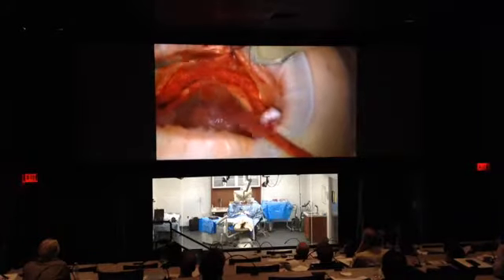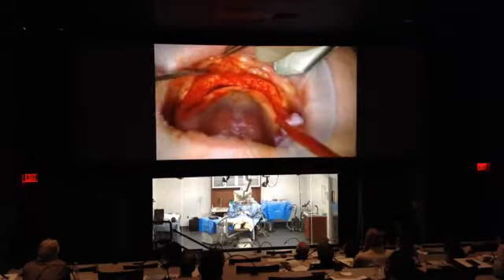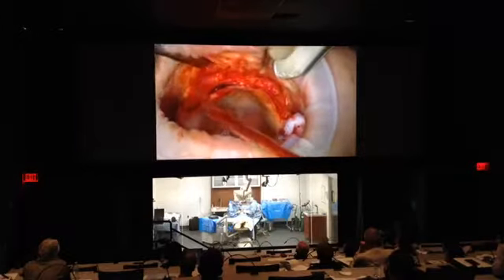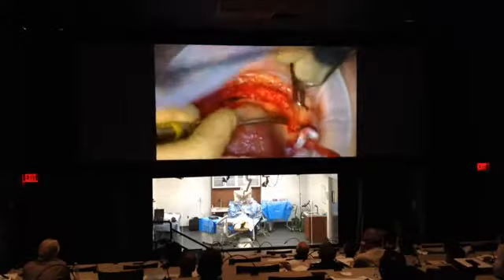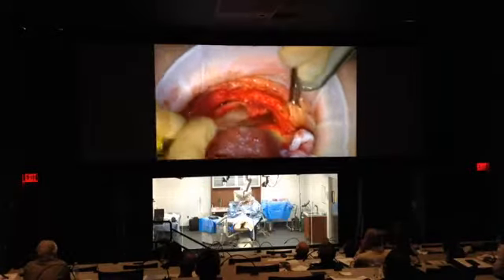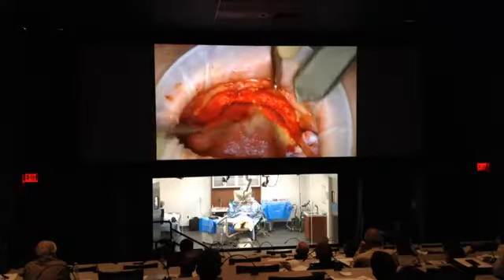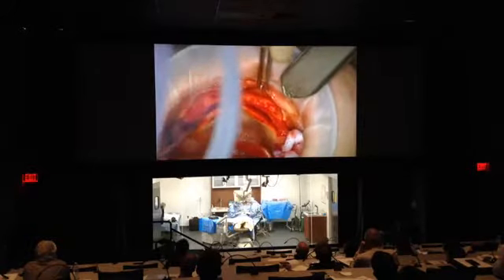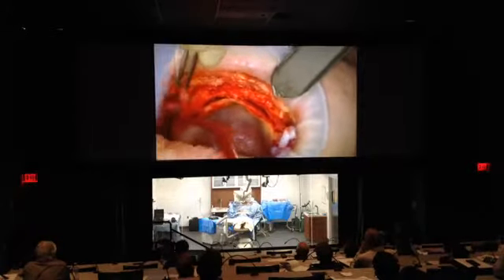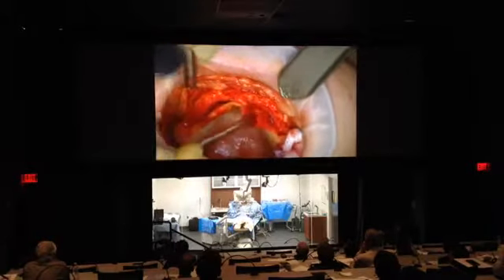Okay. So here we have good reflection of this flap. Very important, I want to see the apical part of the implant. Why am I reflecting this flap? Because I want to see what's going on apically, especially for those of you that are first starting with this procedure. You want to make sure that you see where this implant's going, so it's not going in open space or in the side of the cheek there, outside of the bone.